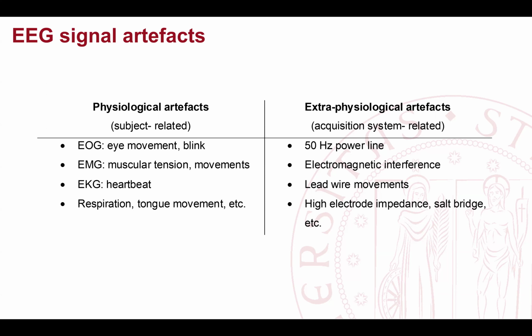So if I move my pupils to look around, then I can see this movement in the EEG signal. It could be useful because eventually you can have this information in your recording, but for that, maybe an eye tracker is better. So even if it is an electrophysiological signal, this is not the signal of interest for us. We are interested in the brain activity. So this for us is noise.